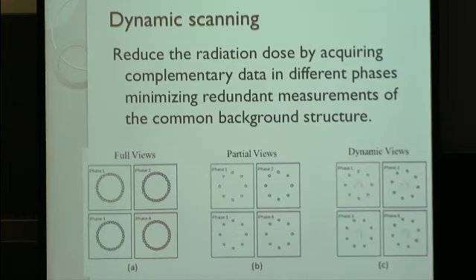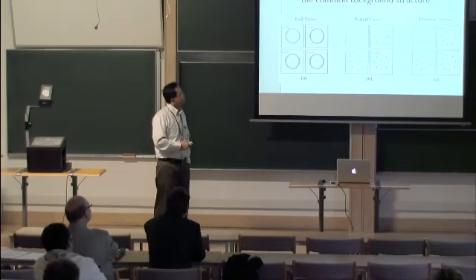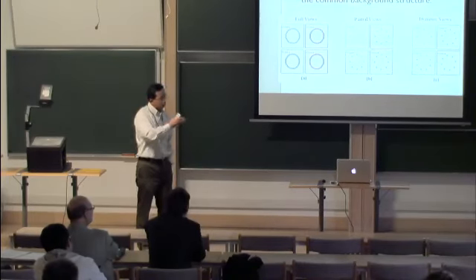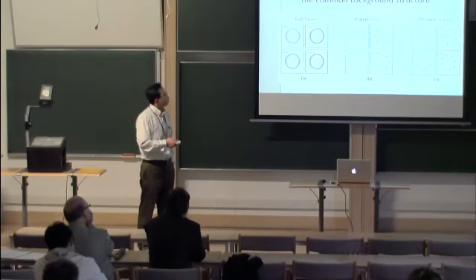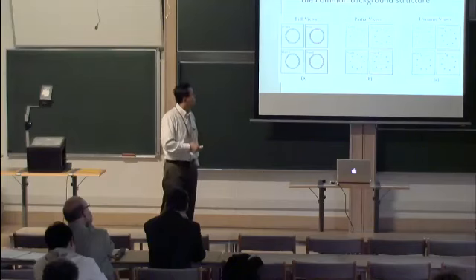I think this also, you know, when we took the same taxi here with Li Hong, maybe there are other ways of doing this partial view for these optical things that could be aligned. If you measure the different views, the question is how to fuse them together. I think there could be some interesting things using this. Each one is a partial view, but you fuse them together using some kind of alignment. I will tell you some alignment we propose.